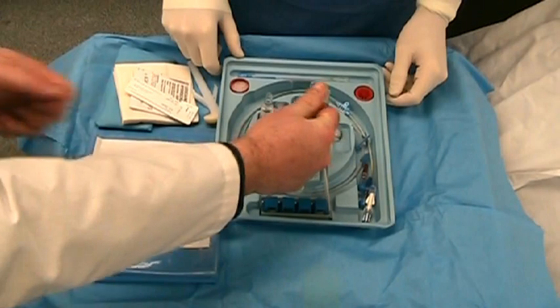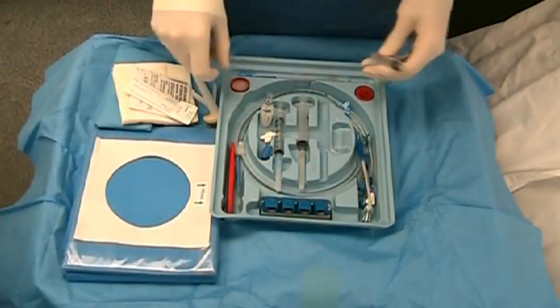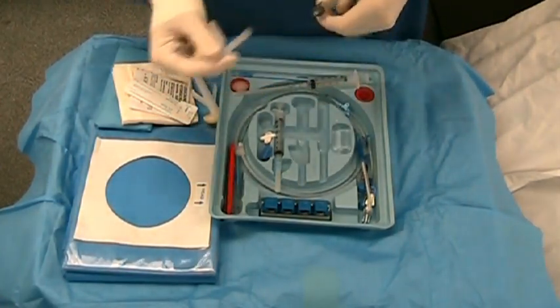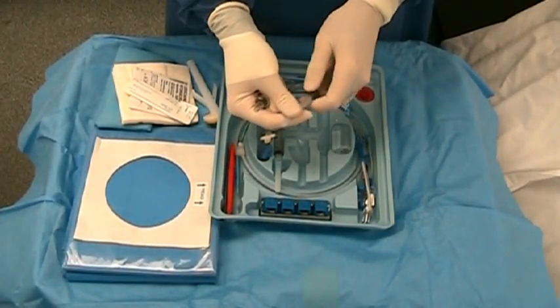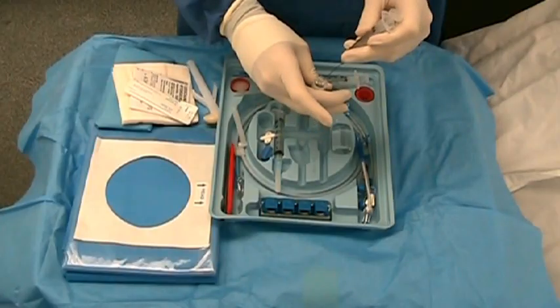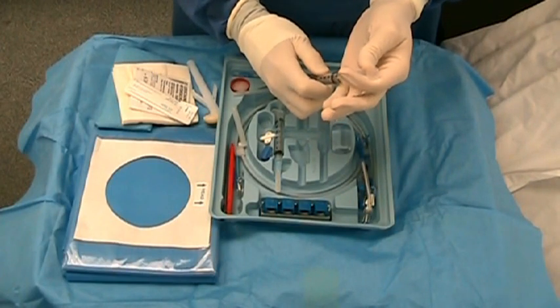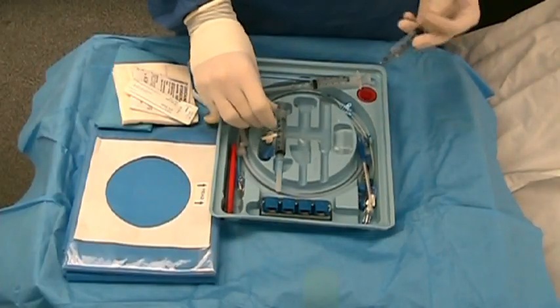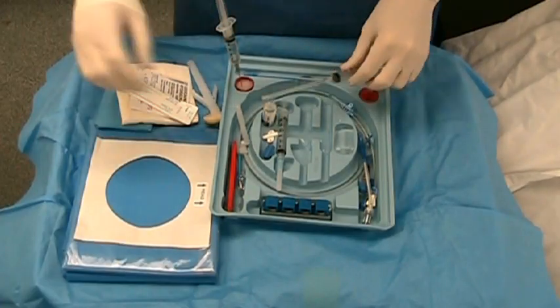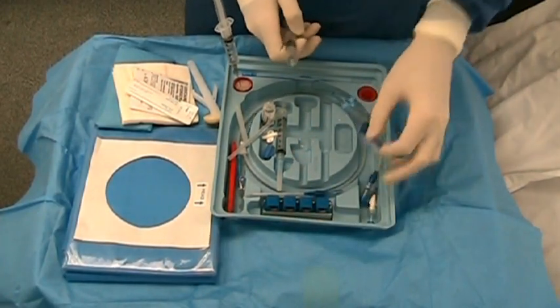The assistant should empty sterile saline onto the tray. The cap is broken off the lidocaine and the lidocaine is drawn into the syringe. All ports of the catheter are flushed with saline to remove any air from the system.